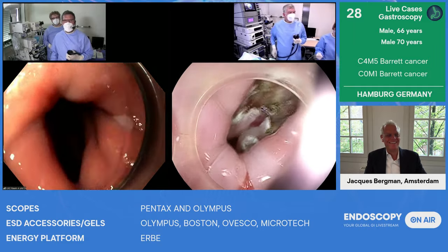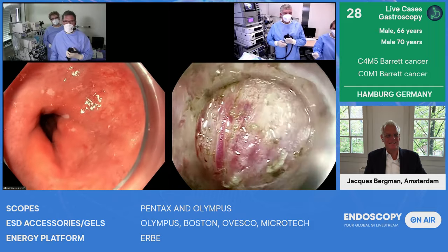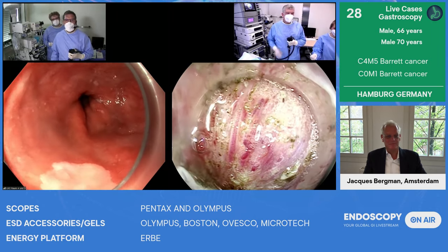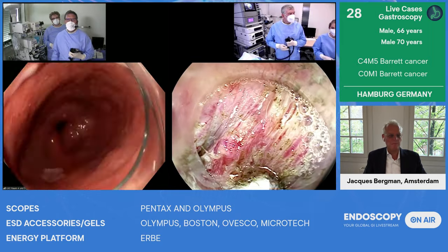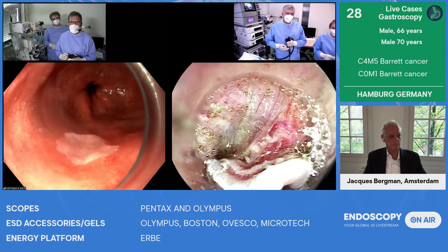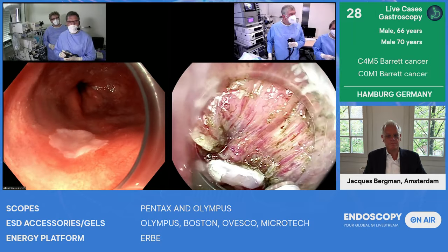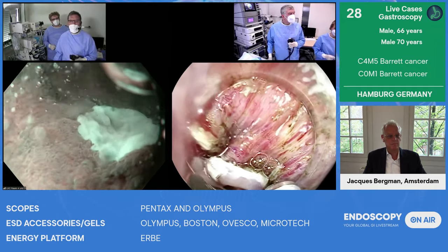Just kidding, Helmut. So this is a very interesting case, Thomas. Thank you for this case. This is a patient with a long segment Barrett, and as you said, it looks quite normal. There are some small islands which are absolutely regular. And going back, there's a larger island here. And then here is the end of the Barrett. And as you showed in your image before, this island was obviously suspicious. There was an ulceration and it healed under PPI. And meanwhile, it obviously is more covered, but there is obviously a cancer below this island.